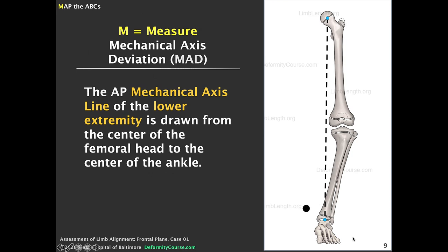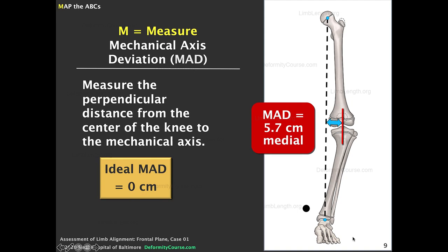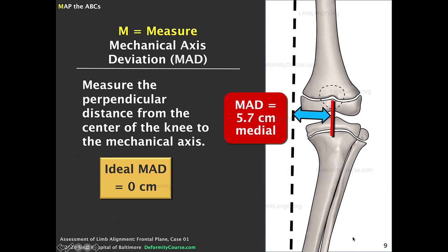We start by drawing a mechanical axis line, which is defined as a line from the center of one joint to the center of another. Here we're drawing the mechanical axis of the entire limb from the hip to the ankle. We then measure the perpendicular distance from the center of the knee to the mechanical axis line — in this case it measures 5.7 centimeters, which is way off. It should be zero, passing right through the center of the knee.